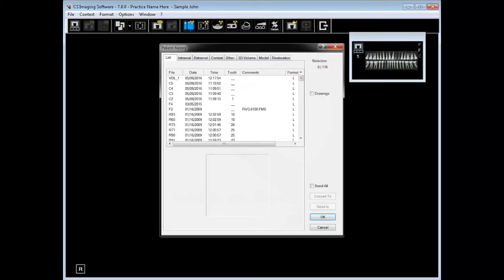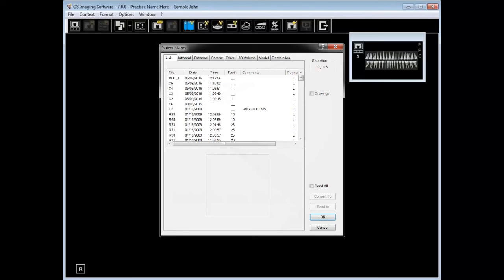List, as displayed here, will list all of the images for the current patient and details about the image which include the date, the time, the tooth number, a comment, a file size. Any one of those headings can be used to sort the images. If you knew what date it was taken on, you could sort by date, you could sort by time.